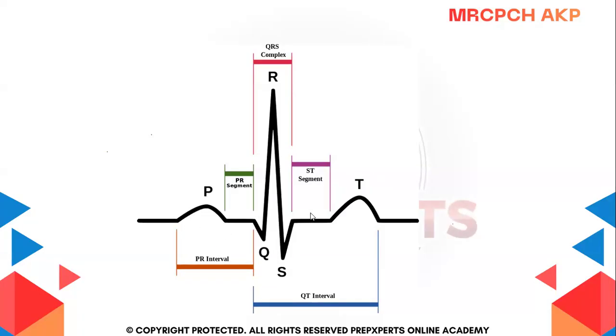Same goes with the ST segment and QT interval, because we are calling it an interval because it has the Q wave.